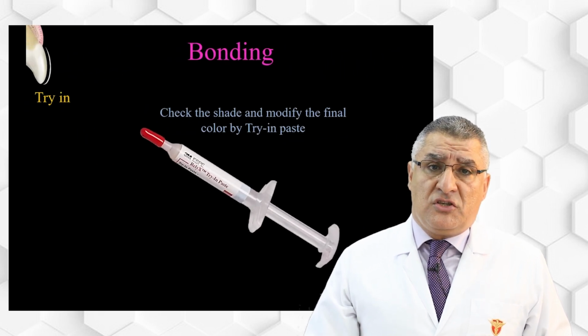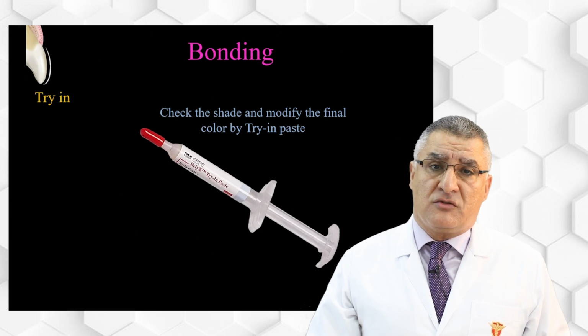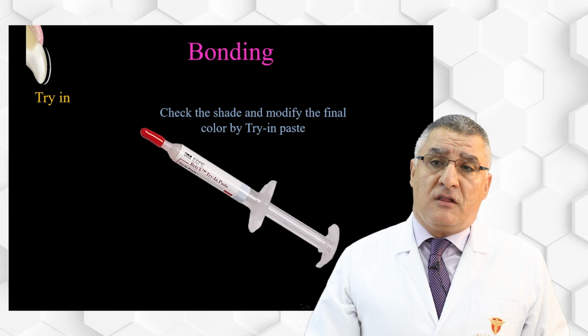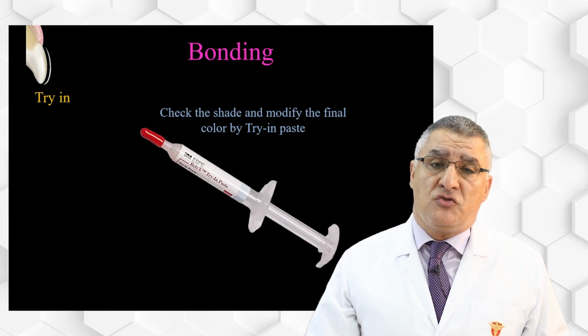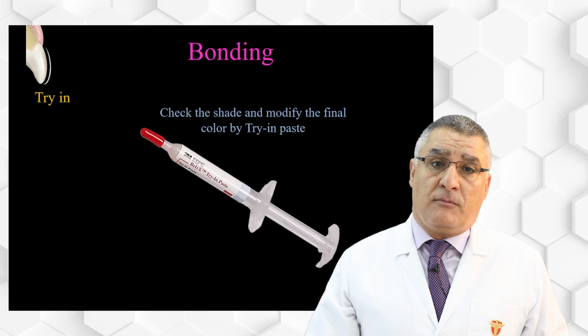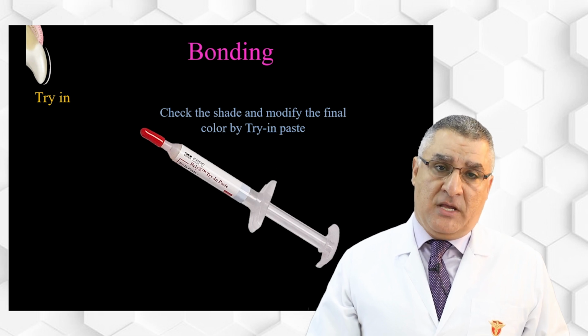We check the fit, we check all of the things. The only thing that should not be checked before cementation is the occlusion. So we have to check the fit, the shade, and the form and shape of the veneer. All of this should be checked, but avoid checking the occlusion before cementation. Occlusion will only be checked after bonding or cementation, because if you check the occlusion before cementation or bonding, this may lead to fracture of the veneer because it is not supported by the resin material.